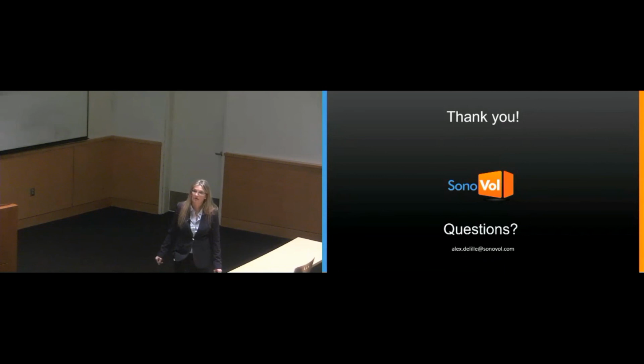Yes. So that's why we do recommend, when you get a new model, I personally like to evaluate how I'm going to position. Am I going to use gel? Am I going to use water? What probe am I going to use? So you do want to spend a little bit of investigative time initially to determine that. Because the way it happens is the sound waves lose energy with depth. So if you use a higher frequency probe, you have just about a centimeter depth penetration, so then you want to probably flip-flop your mouse. I should have probably put the slide up where I have an image on the supine side and an image from the prone side. I think that would be helpful. It's a good idea. I'll put that in the slide deck.